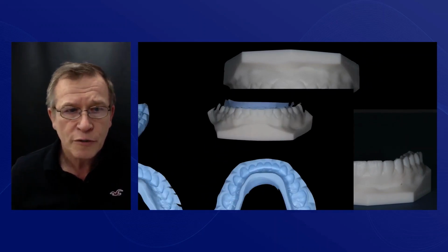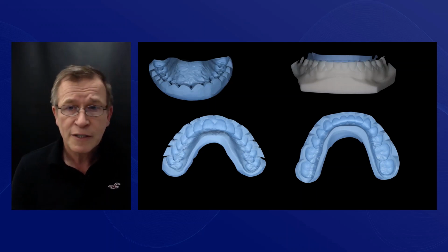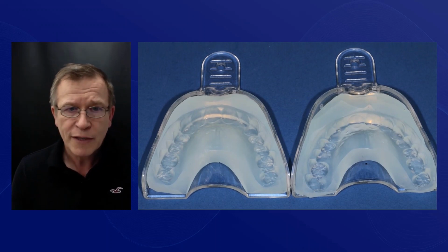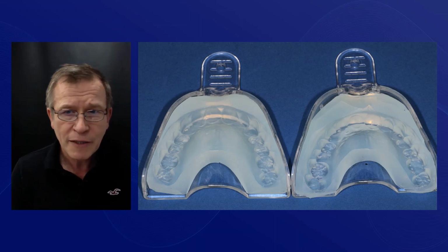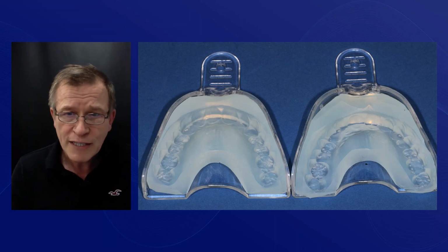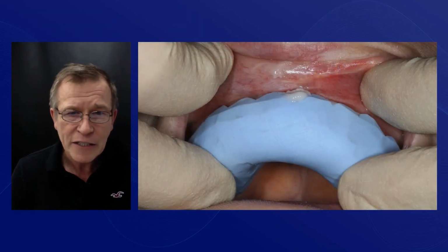Now on the front teeth, she already had some veneers. We needed to cover the palatal surface. These are the stents that we made from the printed models. Going forward, I think now even, but certainly in the future, we will be able to print these stents, and we can actually cut out that middle phase again. These were some clear stents that we made so that we can make the composite. Again, we're starting to be able to print the stents with great accuracy. We can actually print the pieces and just glue them on, which is making life easier and easier all the time.